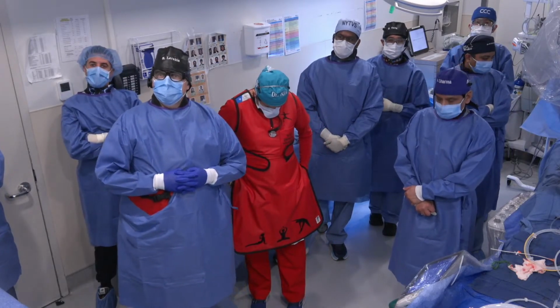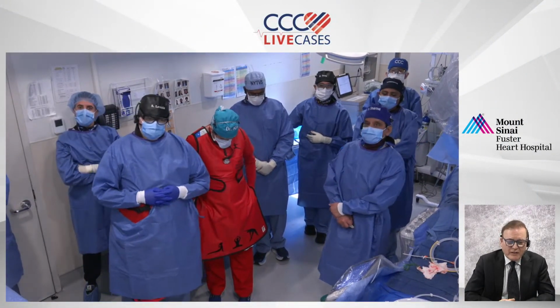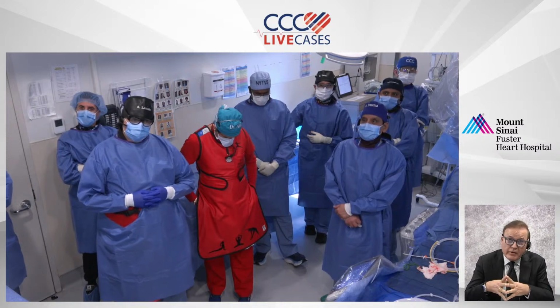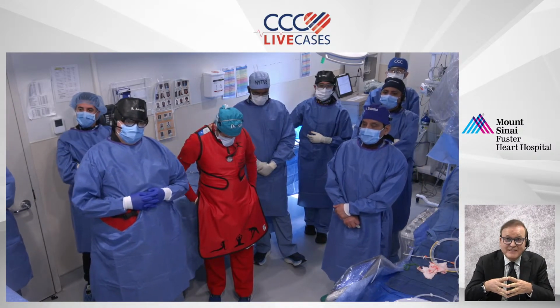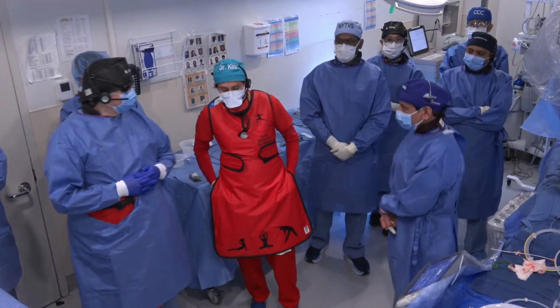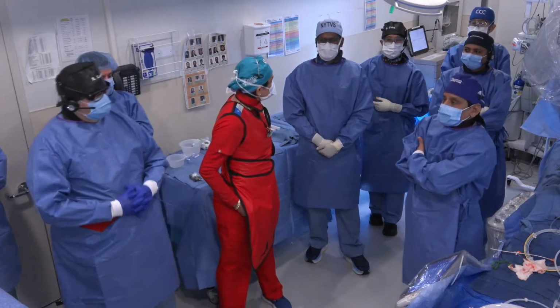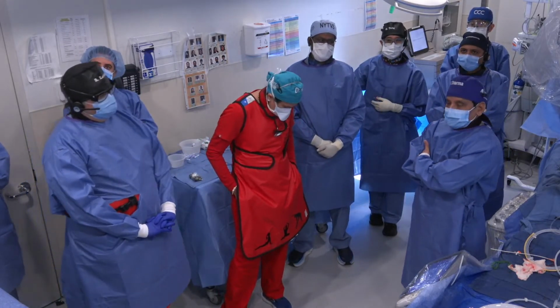Fantastic. The second question is a little bit futuristic: what if you have a tremendous calcium nodule and the PVR is not going to get better, can you use IVL? Yeah, so the question is, which IVL are we going to use then? The peripheral, coronary? IVL has been used for various issues, but I don't know whether it's going to work in this.